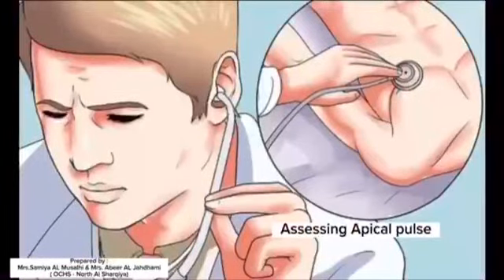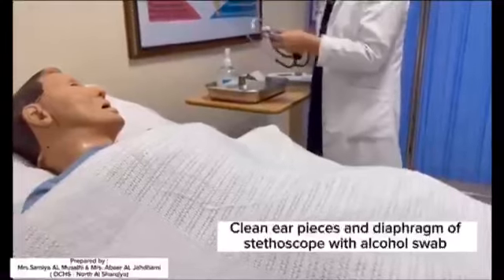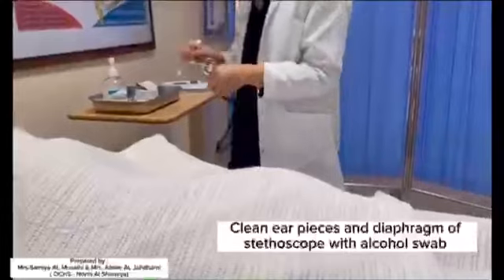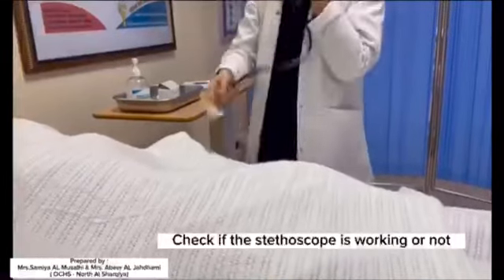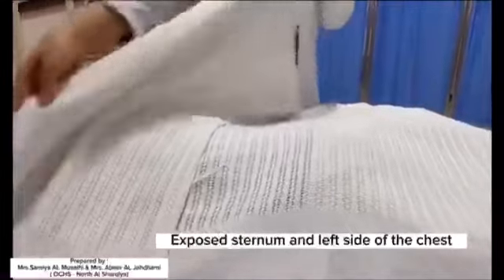Assessing apical pulse. Clean earpieces and diaphragm of stethoscope with alcohol swab. Check if the stethoscope is working or not. Expose sternum and left side of the chest.